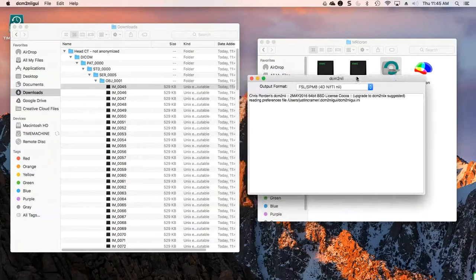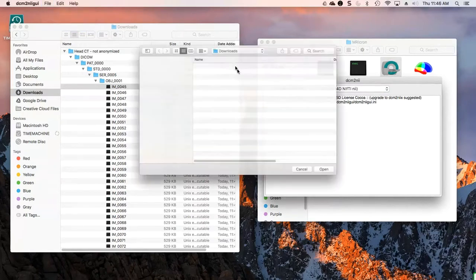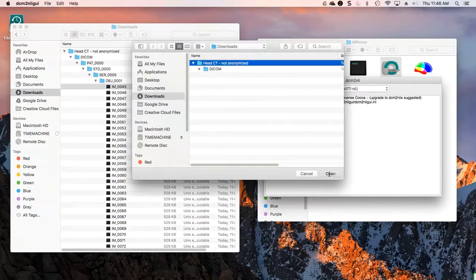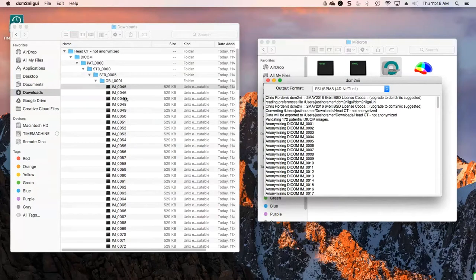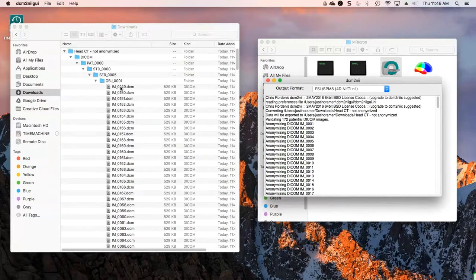So if you open it up, you can see it's a pretty simple interface. The first thing we're going to do is anonymize the DICOM. If you go up to File > Anonymize DICOM, that's how you get started — just select the folder that contains your DICOM and click Open. You can watch it work here. It's going to add a bunch of different files that have the same name but now have a DICOM extension, and that kind of helps you identify which files are actually anonymized.